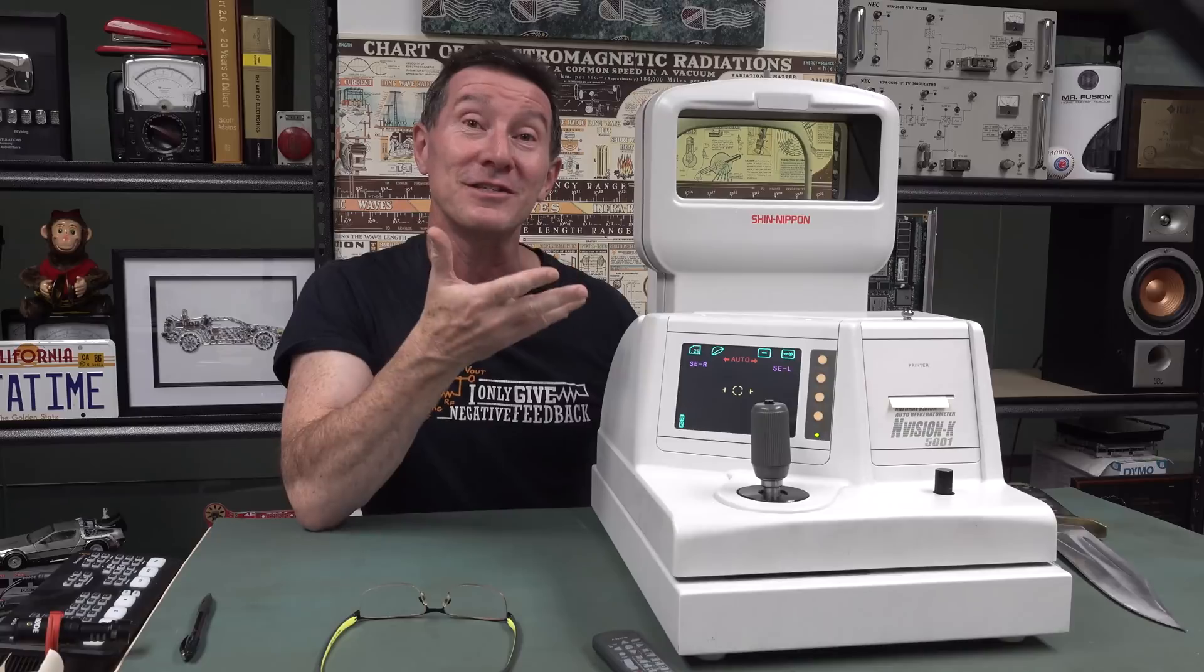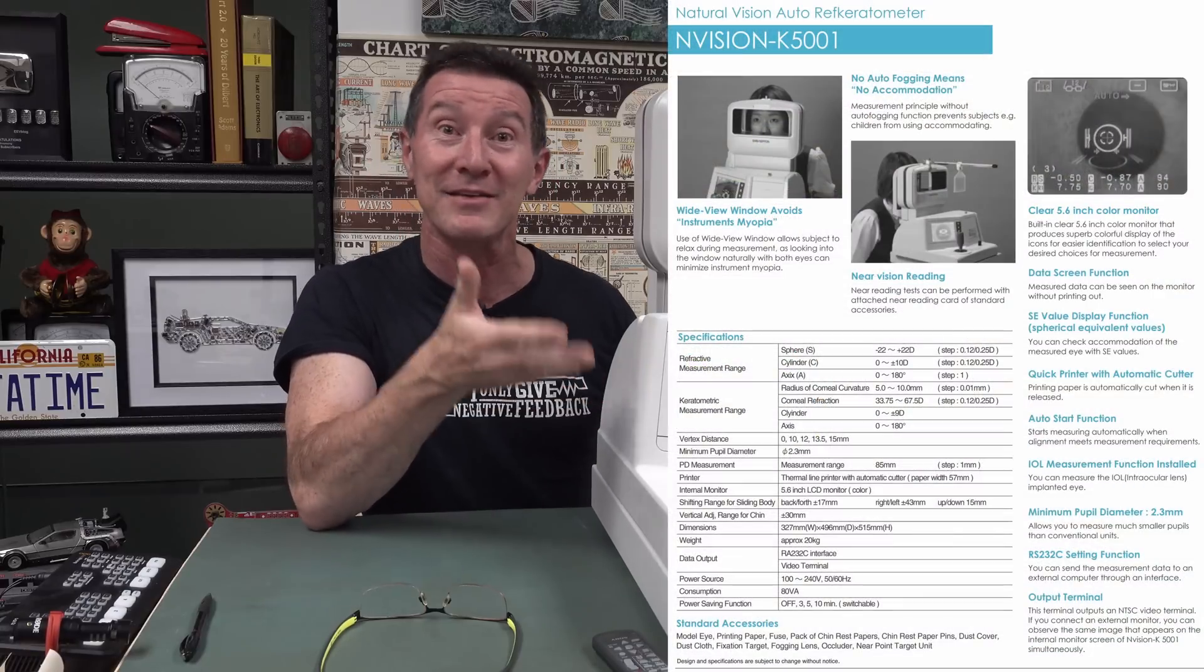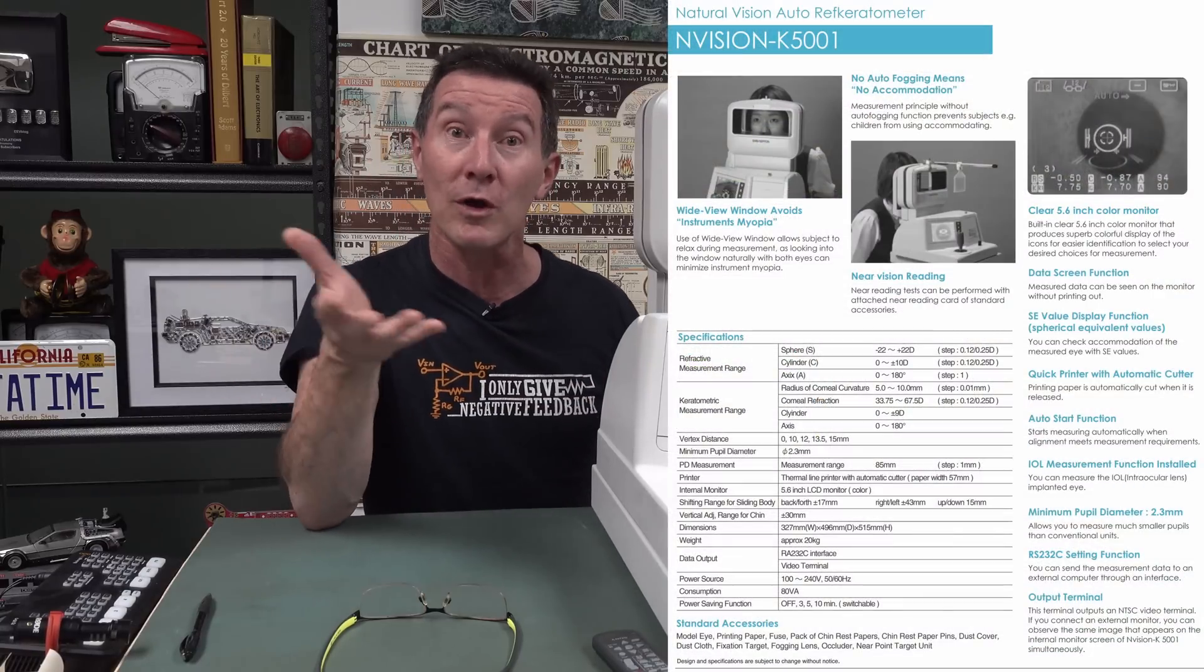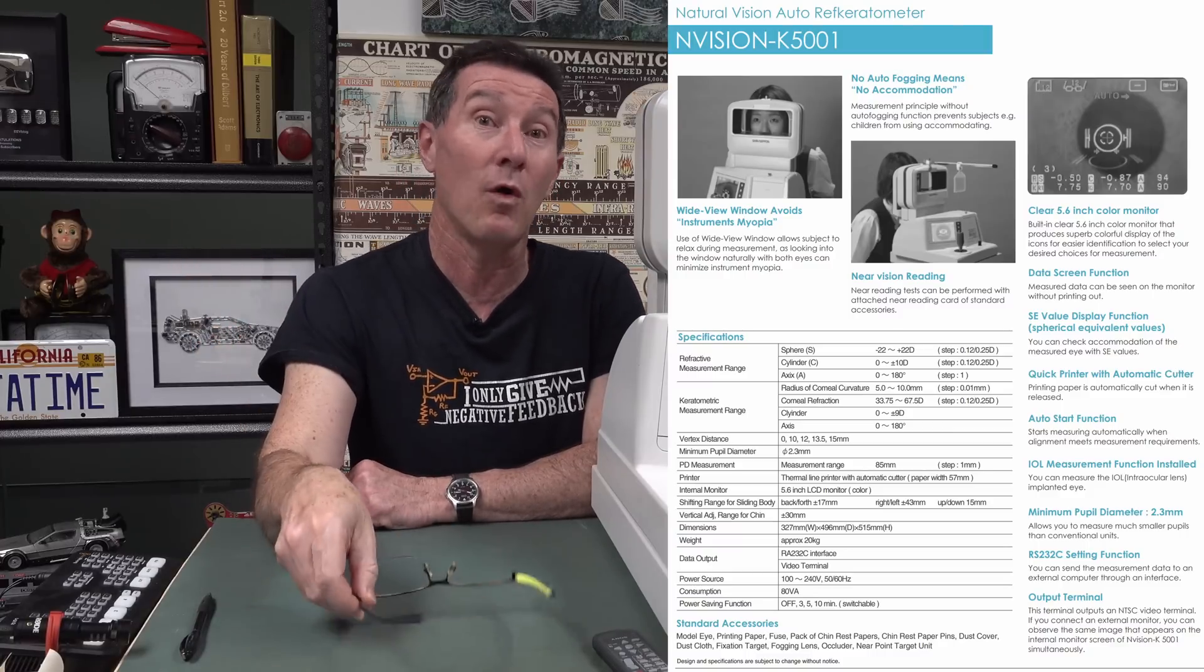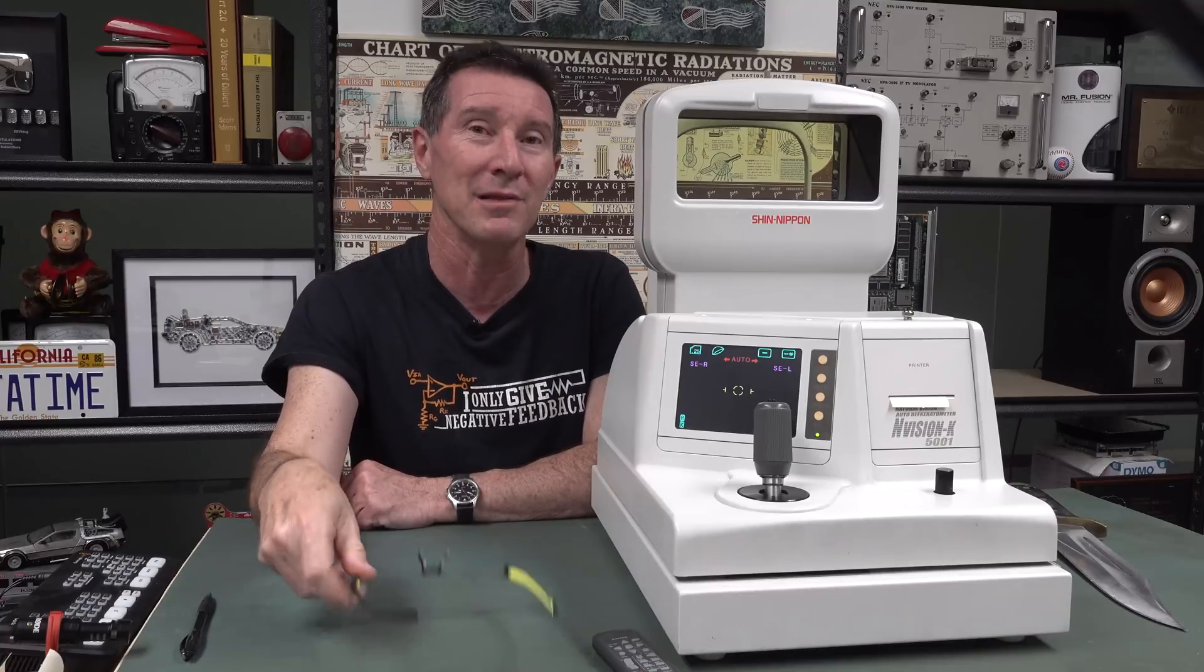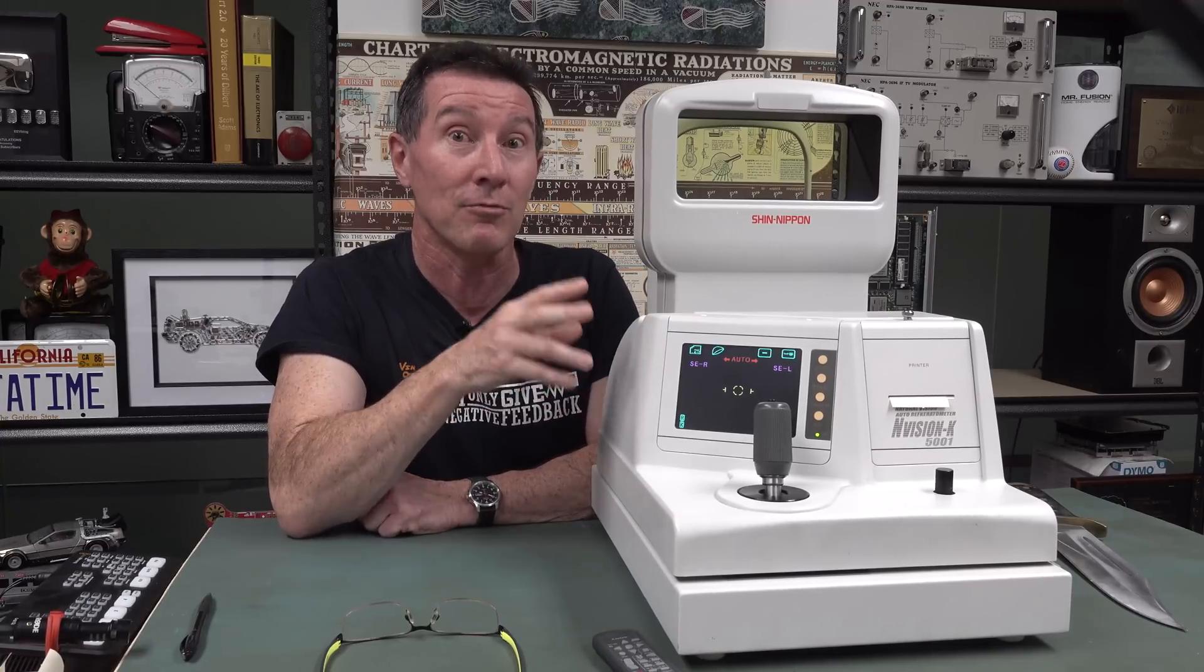And what does this thing do? Well, you might have guessed that it has something to do with optometry, something to do with measurement of the eyes, and indeed it is. This is an industry standard bit of kit for your optometrist or ophthalmologist. They can use this to measure the refractive error of your eye, and hence whether you're short-sighted, far-sighted, and what prescription you're going to need for your goggles. This keratometer is actually better than a regular autorefractor because the keratometer part measures the curvature of your cornea as well. So this actually is two instruments in one, basically.